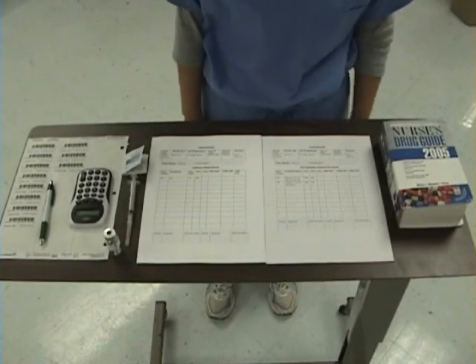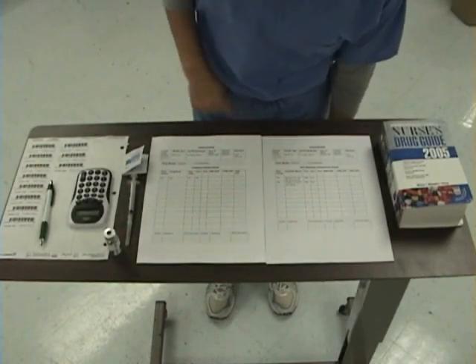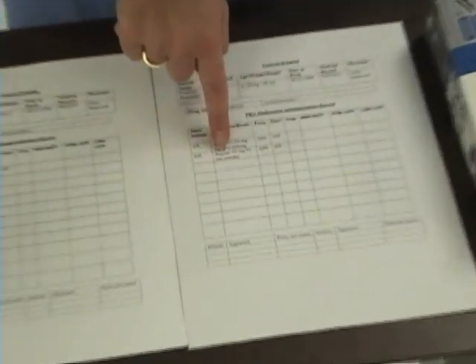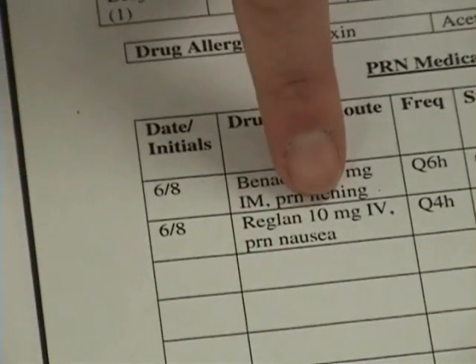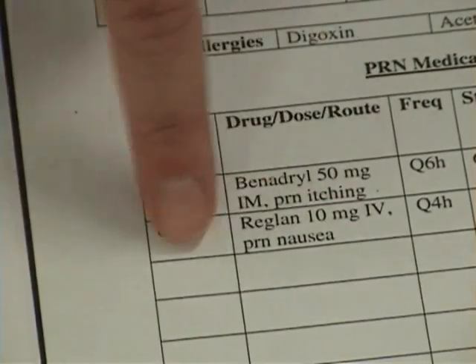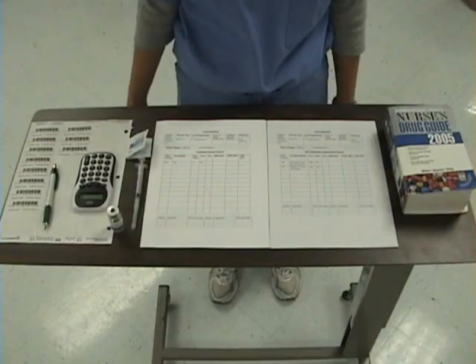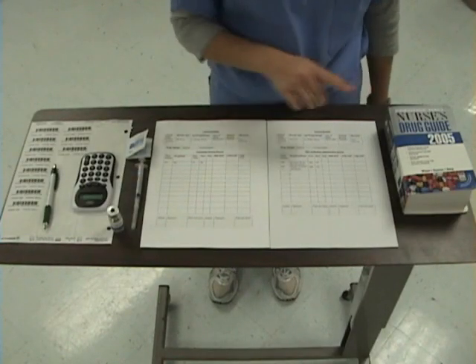My patient has been reporting nausea today. I am going to check my MAR, and I note that the patient has ordered Reglan 10 milligrams IV push PRN nausea and has not received a dose today. I will begin by gathering my supplies.